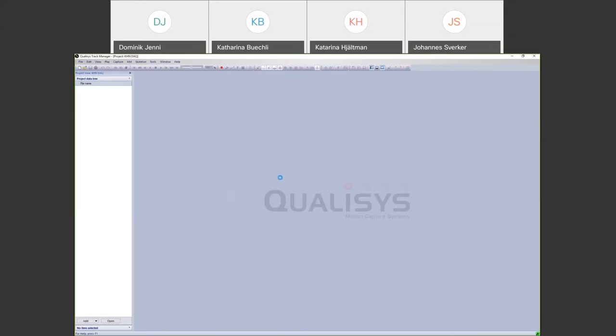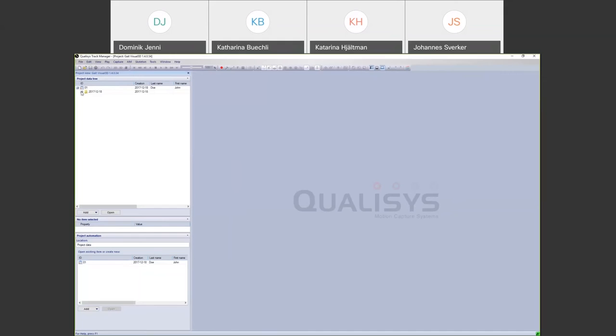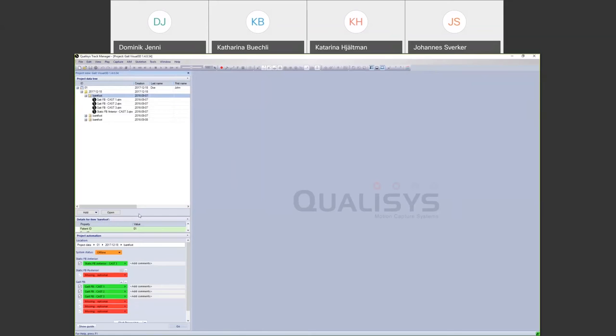Switching to an example gait project, you can see how the session looks in QTM. Selecting a session shows subject information and the different measurements that have been done. During capture, you are guided to make a static recording and a certain number of dynamic files, which of course also includes gait force plate data.